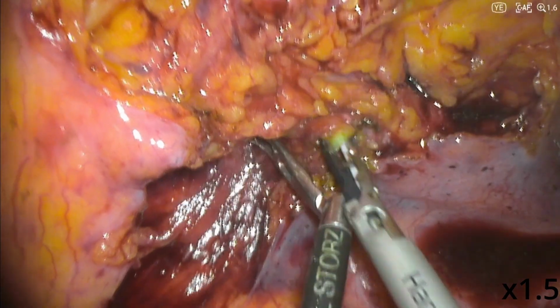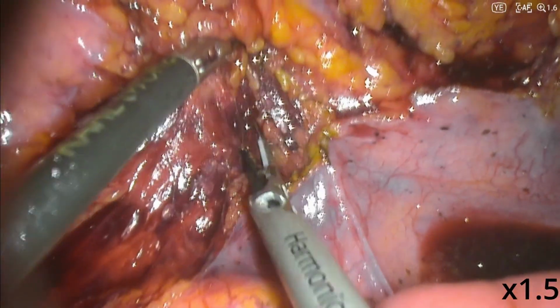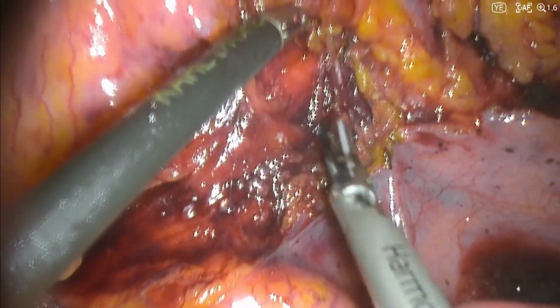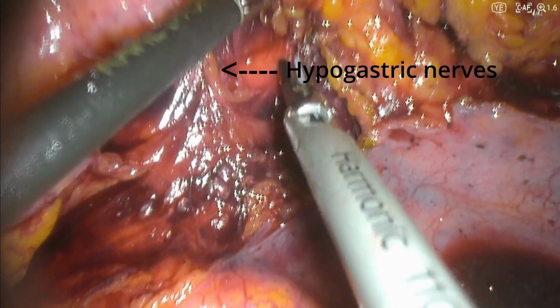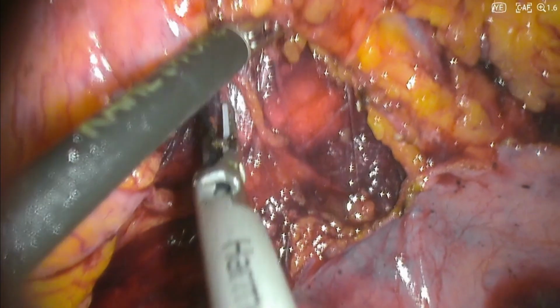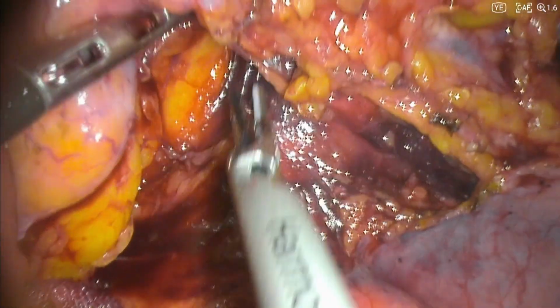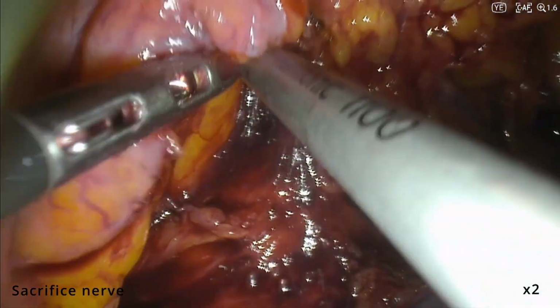Other crucial structures that can be identified easily with yellow enhancement are the retroperitoneal hypogastric nerve plexus. The identification of these nerves is made easier, as demonstrated here. The hypogastric nerves were found by blunt dissection of the overlying fascia and fat. The nerves were traced, and a nerve was sacrificed.